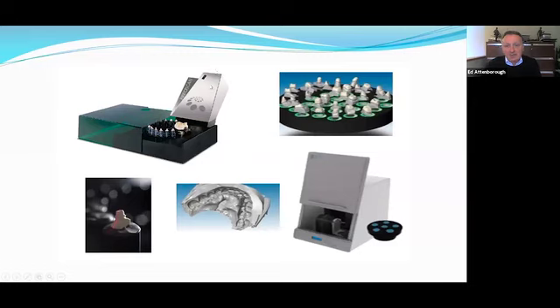We've got a laser projecting down onto the die, and also in here we have a stereoscopic pair of CCD cameras, and they're looking at the profile that's cast by the laser on the die from two different angles. And then using triangulation, we can work back to a point in space, just in the same way that we use our two eyes to look at something from two different angles, and that gives us a 3D perception of depth. So exactly the same principle in optical scanning as our own eyes.